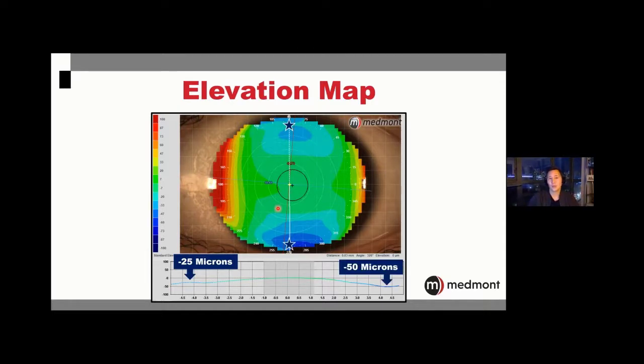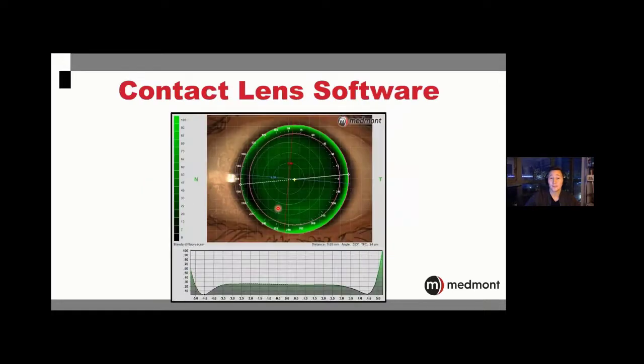So our with-the-rule cornea is much steeper in this meridian, and that drop in elevation allows the contact lens to rock back and forth. So we might require a toric lens for this eye. That might be why the previous lens wanted to fit a little bit toward the flat side, riding a little bit high.